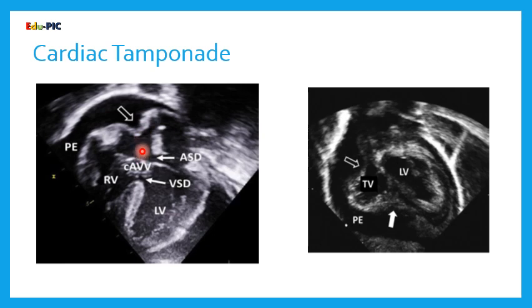This is a sign of increased pressure outside of the heart, and again could be a sign of cardiac tamponade. Also in this image, we can see the indentation of the right ventricular wall, compressed by the effusion, which can cause hemodynamic instability and cardiac tamponade.